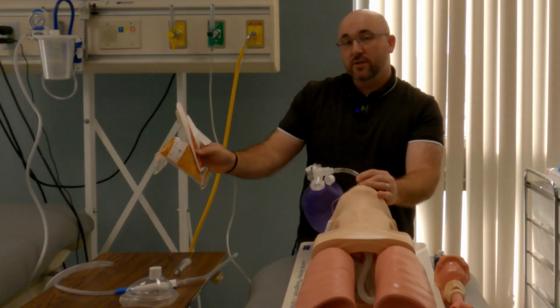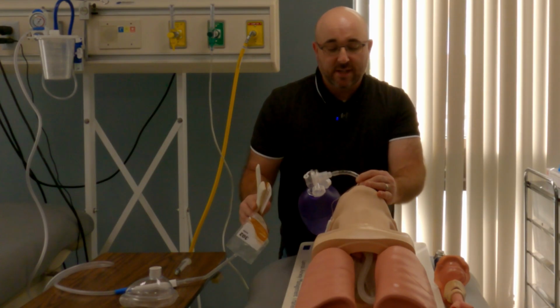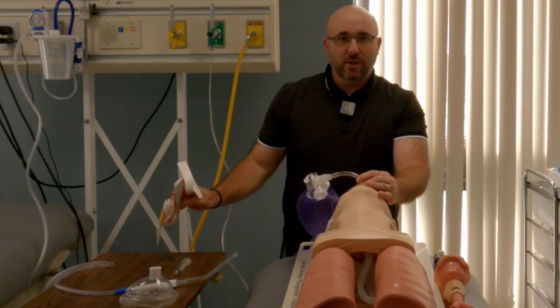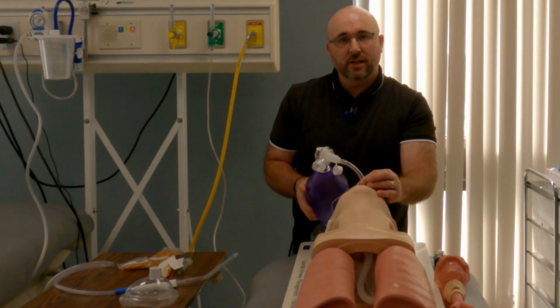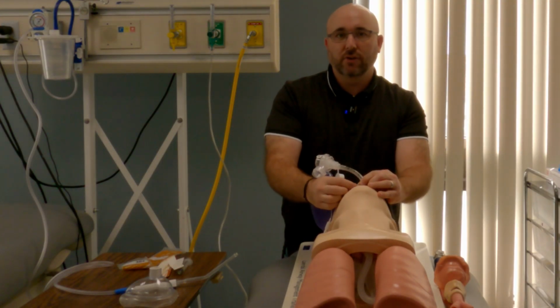And that's why we had those 5 different pieces in that order, because we're going to go to the securing device, and then either the assistant, and if they haven't done it before, that's absolutely okay. The assistant might have to hold the endotracheal tube and ventilate, while the person intubating then secures the endotracheal tube.